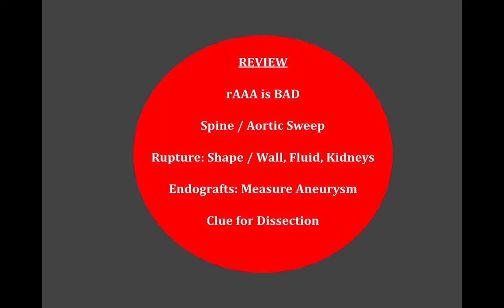When we're physically doing abdominal aortic ultrasound, you need to find the spine and then sweep the aorta. Again, this can be done very quickly, but you need to find the spine. We looked at that major pitfall of looking at the urinary bladder. If you haven't seen a patient who is writhing around diaphoretic in bed because their bladder is so full, these folks can look like a ruptured AAA. You haven't seen enough patients, and you will see someone that looks like that at some point. So you just got to be careful.